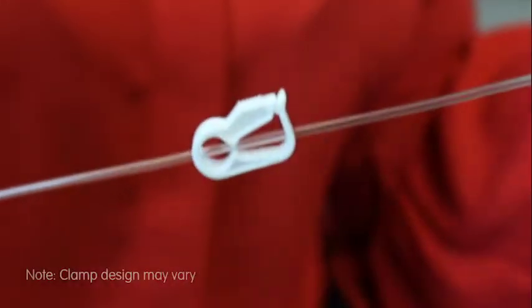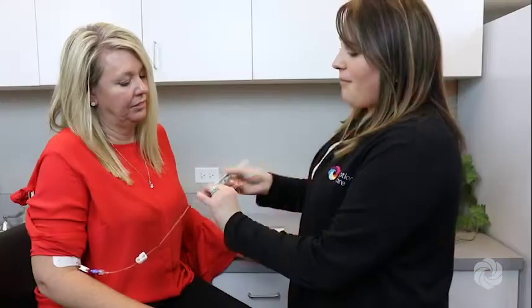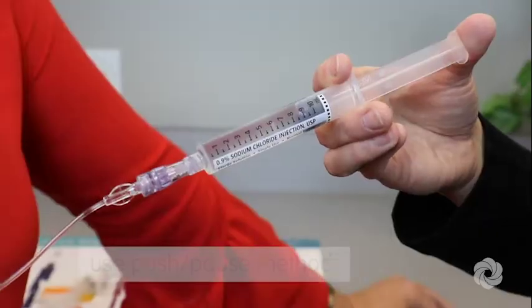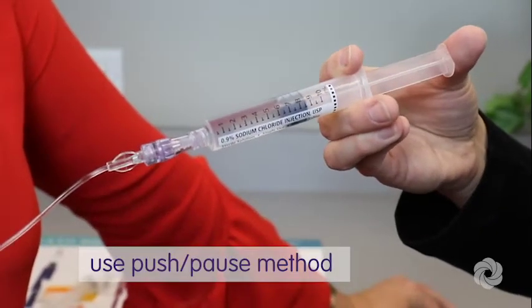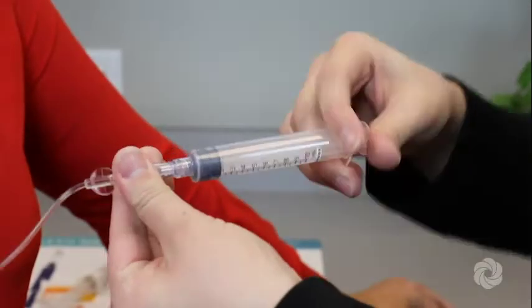Open the clamp on your IV catheter and/or IV extension set if indicated. Flush your IV catheter using a push-pause method. Do not attempt to flush if resistance is met. Double check that all clamps are open, then call your nurse or pharmacist. Lastly, remove and discard the saline flush syringe in a trash container.